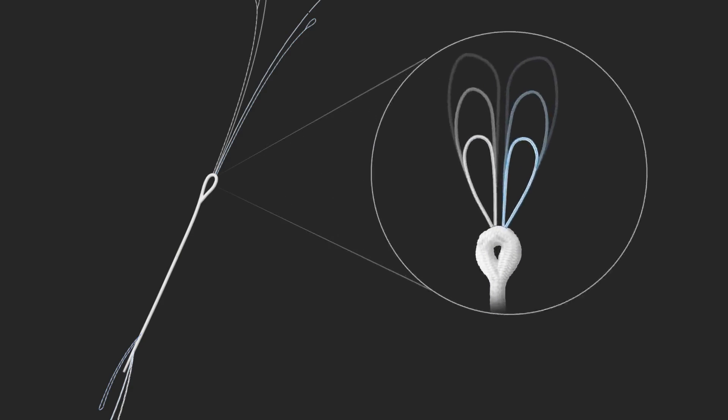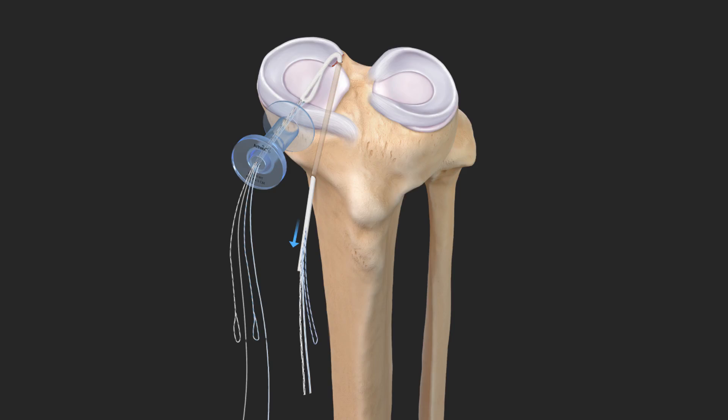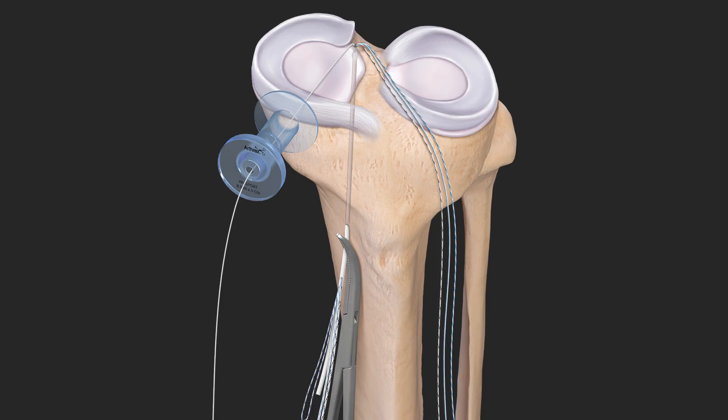Here we see a technique preview for our SutureLock implant. This is an all-knotless implant with two repair sutures that can pass through our proximal anchor fixation. This implant can be passed in a proximal to distal direction at our repair site through the small 2.4 millimeter tunnel. Once the implant is passed it can then be secured proximally at the joint line. An important technical tip: a clamp is placed distally around the distal aspect of the implant to allow passing of repair sutures and passing sutures out of a working portal without prematurely unloading the implant.